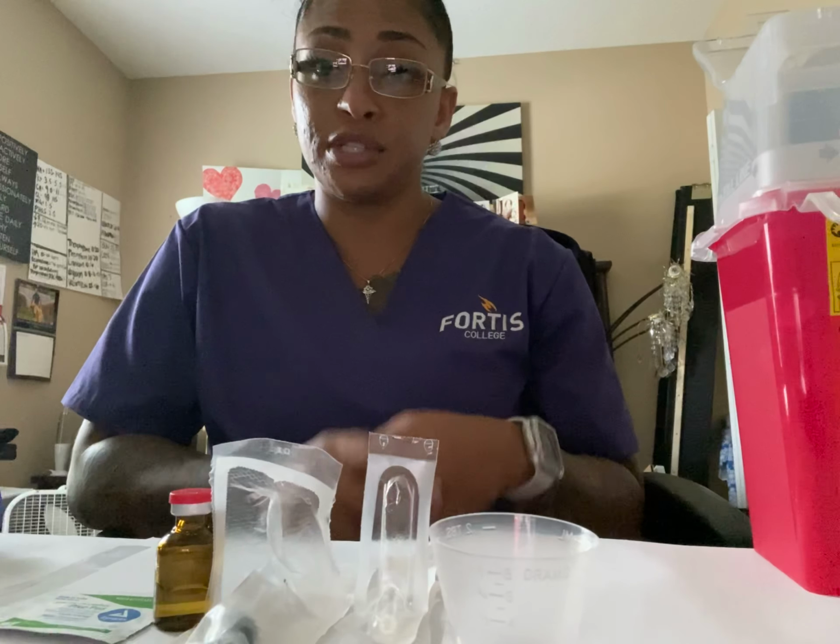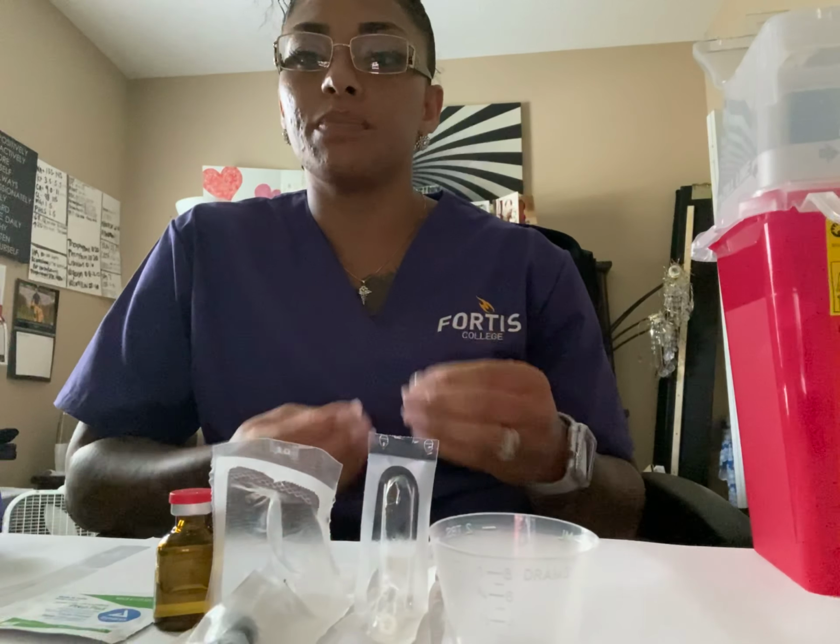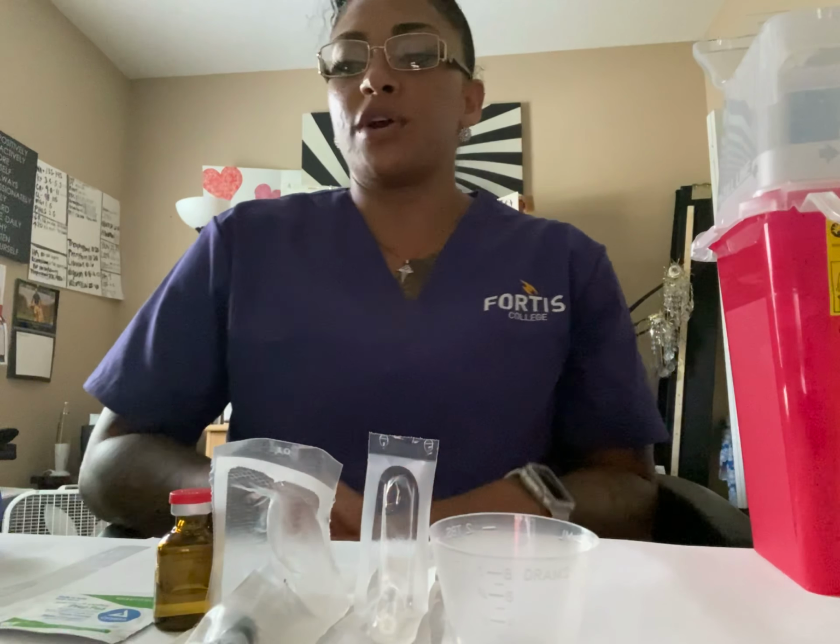I would absolutely check the expiration date. That is one of the most important things: to check the date and to check for any discoloration or any cloudiness in the vial. So we would do our 3 checks of the medication label against our MAR.